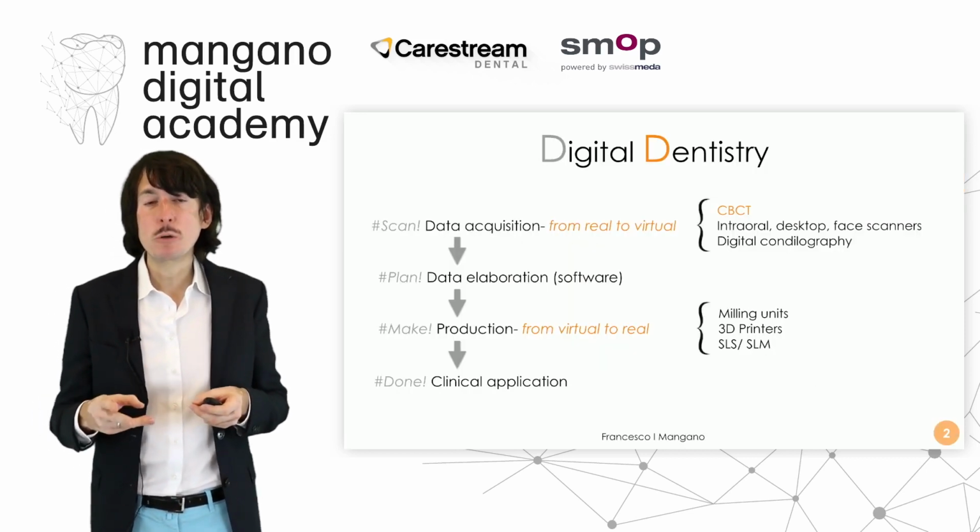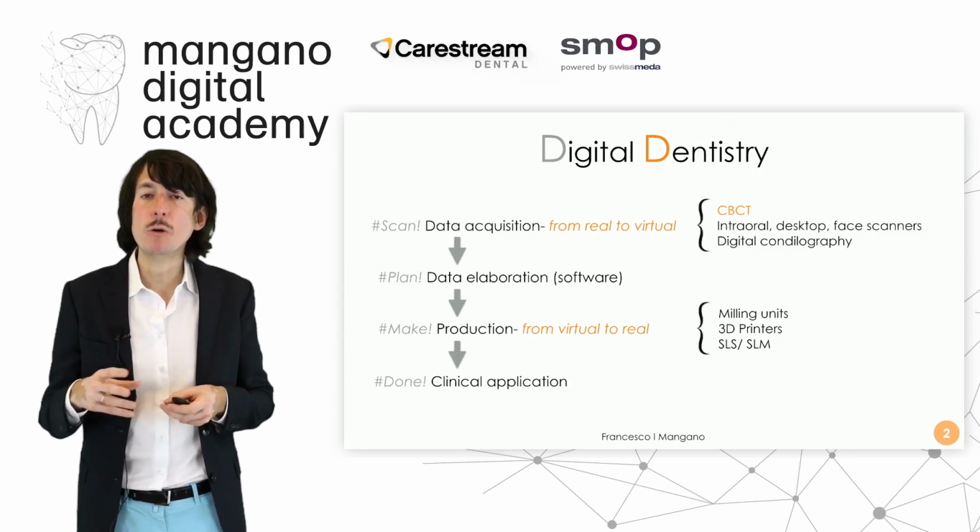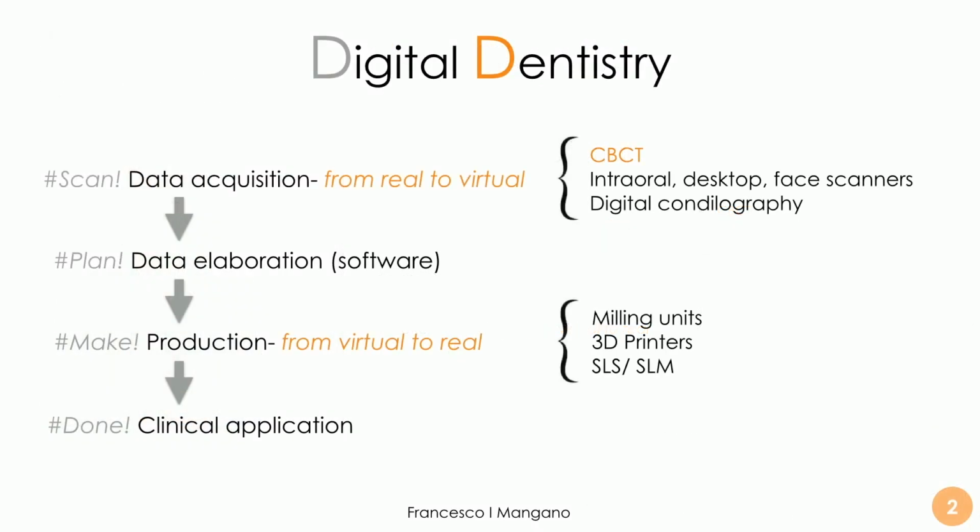Before doing it, let's go back to digital dentistry. We have a scan phase for the data acquisition, in this case an intraoral scan, with and without the implant scan body. In order to transfer the position of the implant from the real world to the virtual world, we need to transfer it predictably.